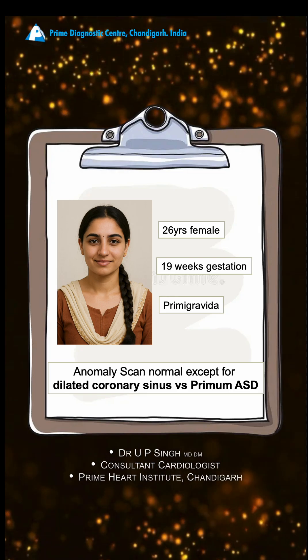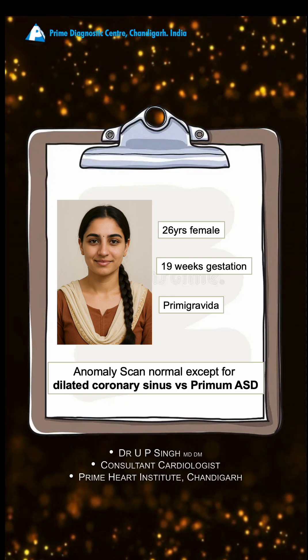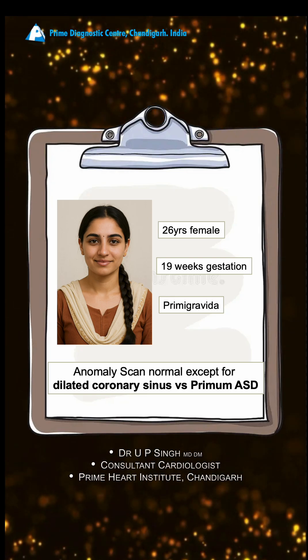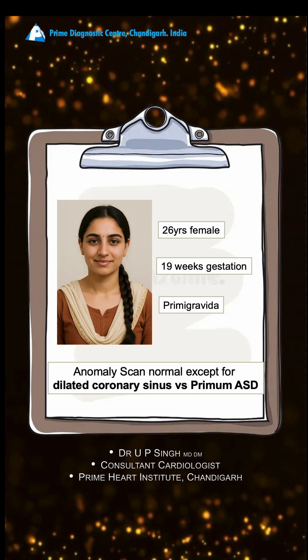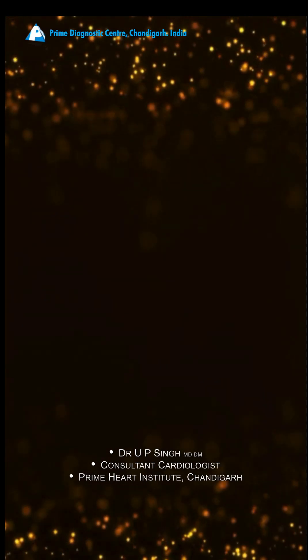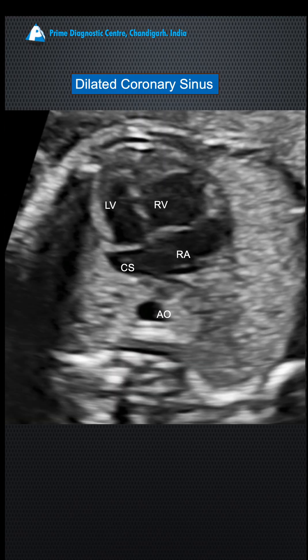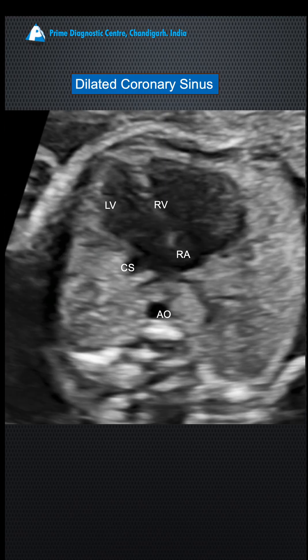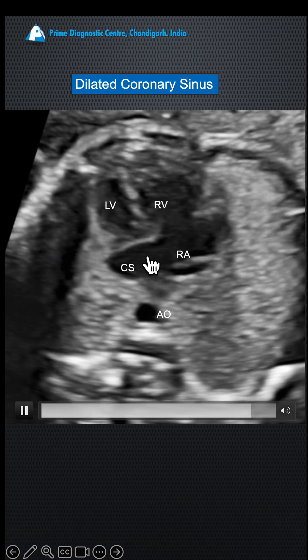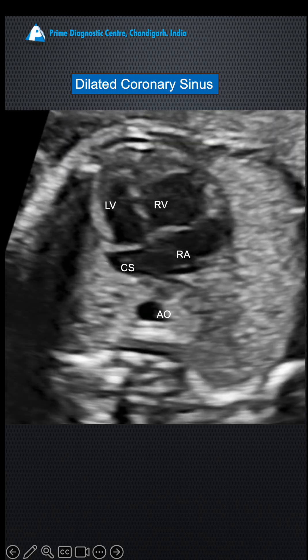At 19 weeks gestation, an anomaly scan showed a dilated coronary sinus. The issue was whether this was a primum ASD or a coronary sinus abnormality. What we saw was that there was a dilatation of the coronary sinus — you can see it here.